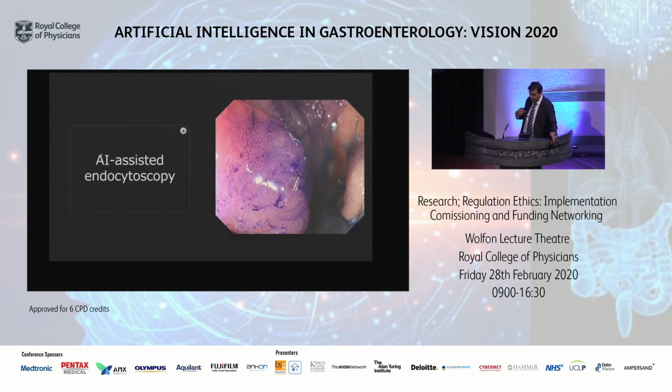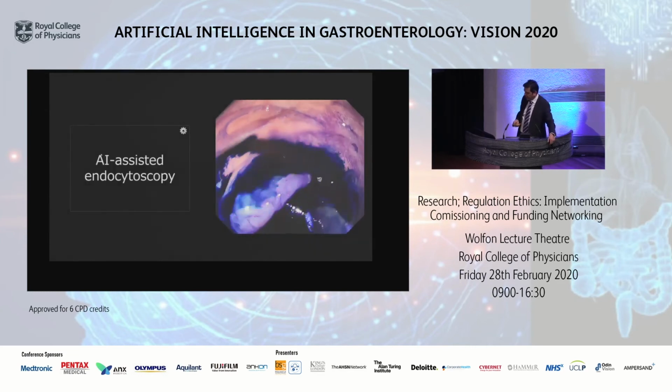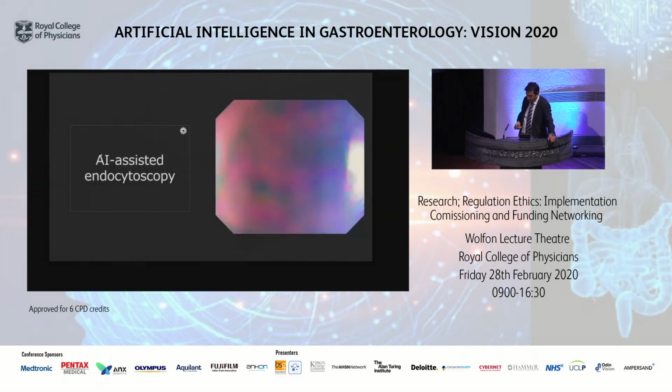Then what you would do in real time is stain the polyp, first with crystal violet and then with methylene blue. Once we've stained with methylene blue, allow that to stand for a minute so that the nuclei can be stained. And this is the lesion that you can see here. Then we can evaluate that lesion in a bit more detail using the endocytoscope and the Endobrain.